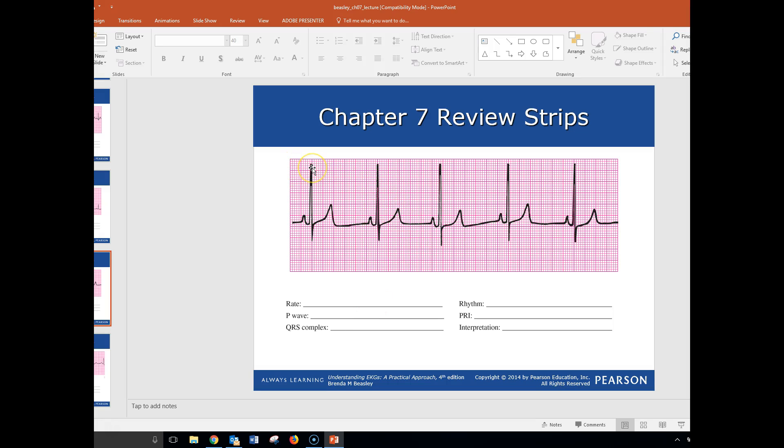So what we're going to do is we're going to find our R wave, which is this guy right here. This is the peak of our R wave, and we're going to find the closest one or the one closest to the dark line. So you have these dark lines. You have the light lines, five of them in between each dark one, and we're going to use those as our markers.